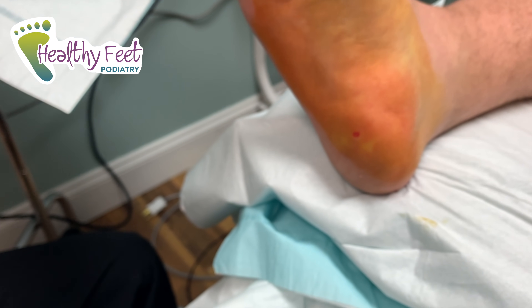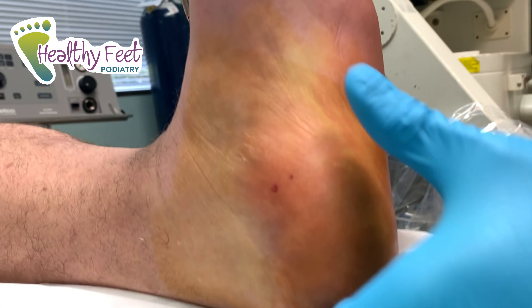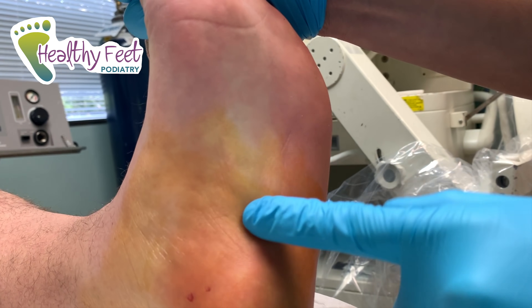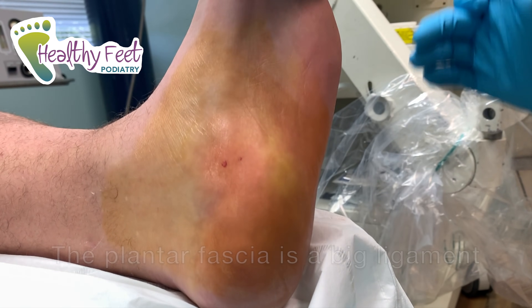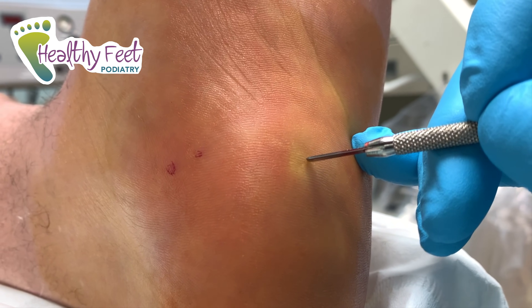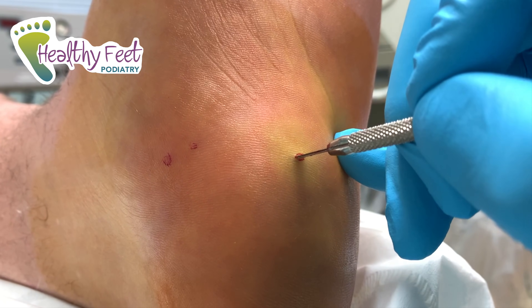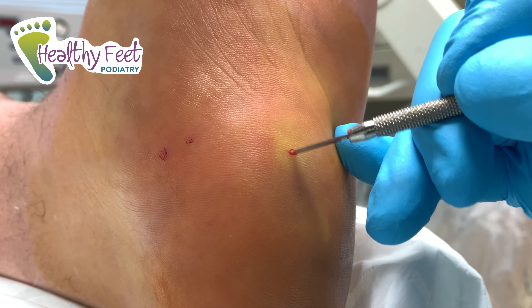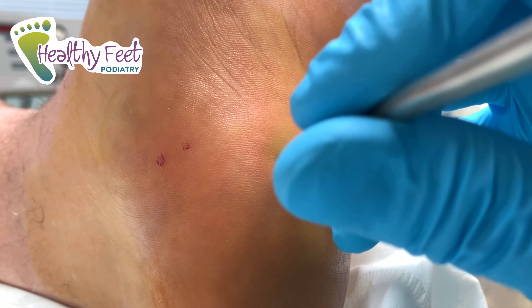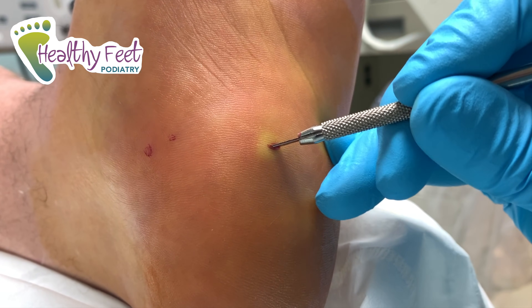That foot's done; we're moving over to the other foot. I can feel the plantar fascia as I go up here — I can feel that tension on it. We're going to enter right here. Anything sharp? Good. It kind of has a crunching sound, similar to cutting through celery, because there are all these fibers that make up the plantar fascia.